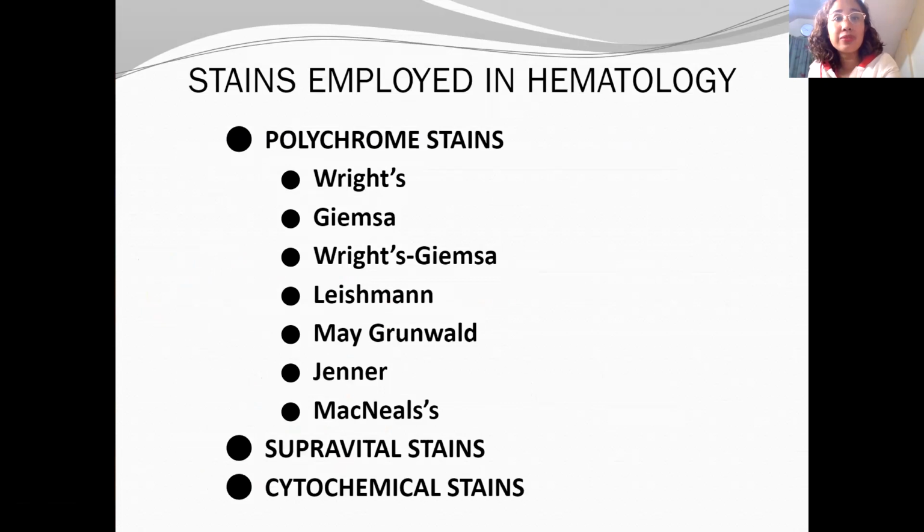And finally, guys, we have stain. Depending on the frequency of how you use stains, for example Wright stain, which is commonly used for peripheral blood smears, what we do every day is filter out the stain because sometimes there are residues and contaminants during the day. Sometimes we replace it, depending on the number of patients. But replace your stains if the stains don't look good anymore.